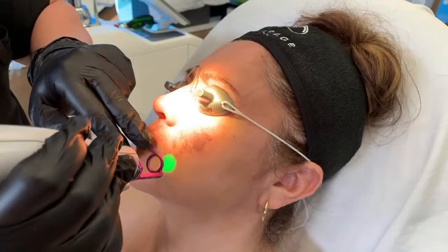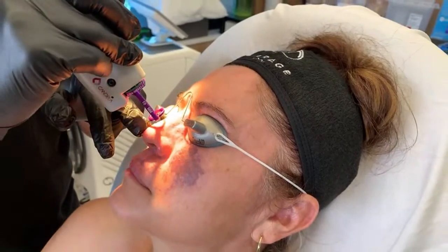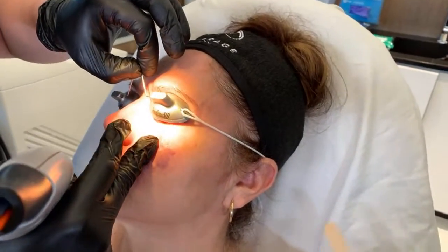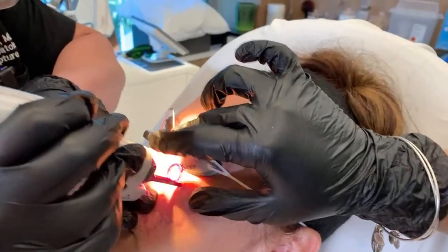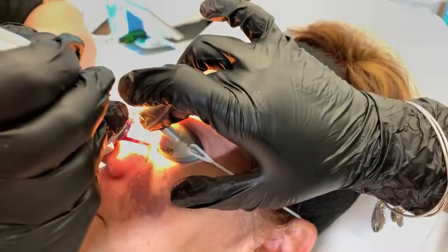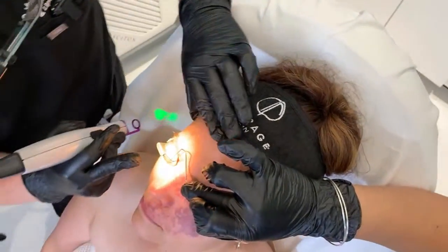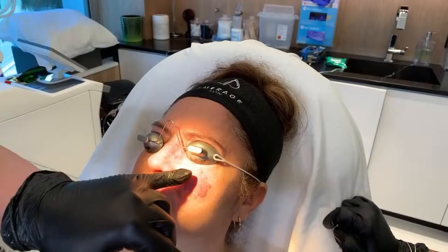A lightening cream would absolutely not get rid of this, but we need it because we don't want her to get hyperpigmentation. Can she wear makeup while she heals? She can. We're going a little higher now — notice we have an amazing goggle here from Innovative Optics, which I helped them create. These white areas you can see here — that means the treatment is very responsive.